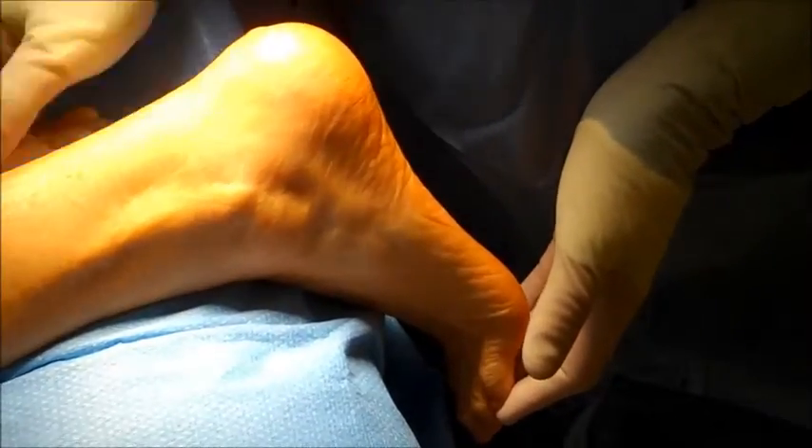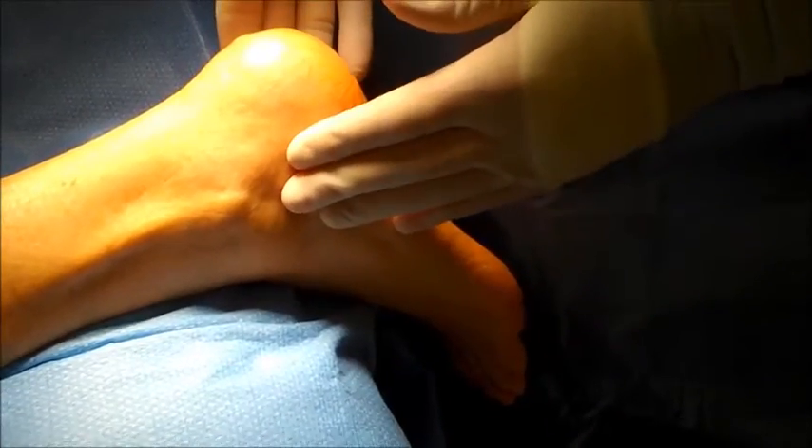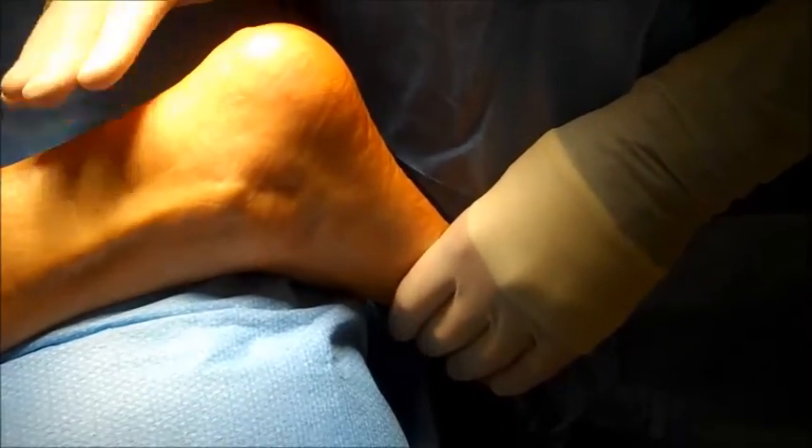Over time, if they don't resolve with conservative care, we actually release part of that band. Typically when we do this procedure, the patient would be on their back. Now this patient happens to be on her stomach because she's having other procedures done with her Achilles.